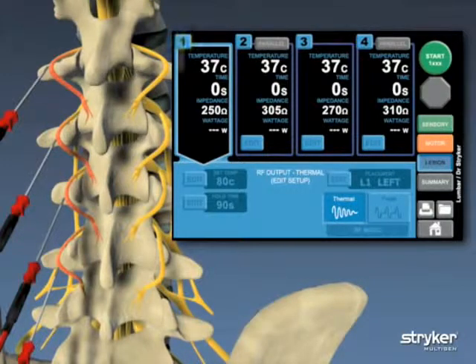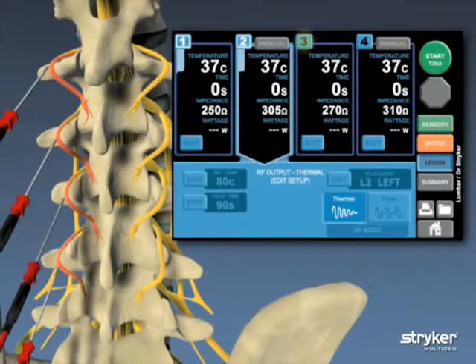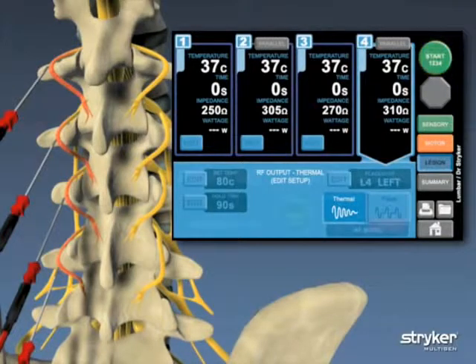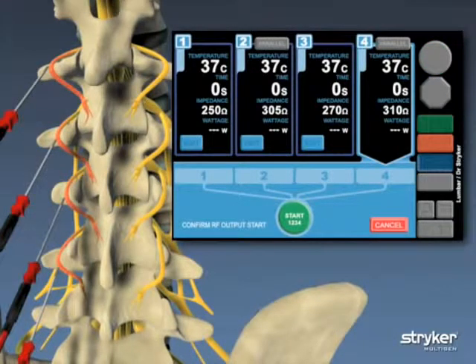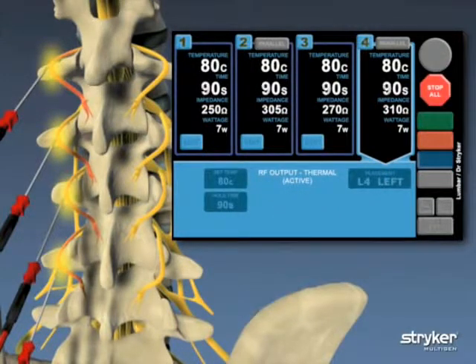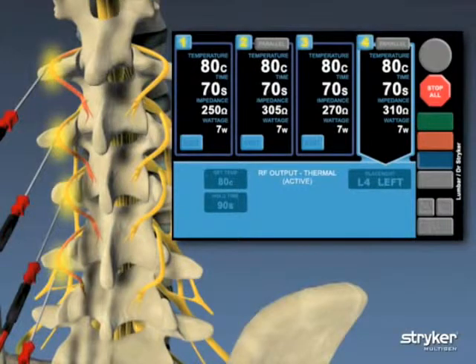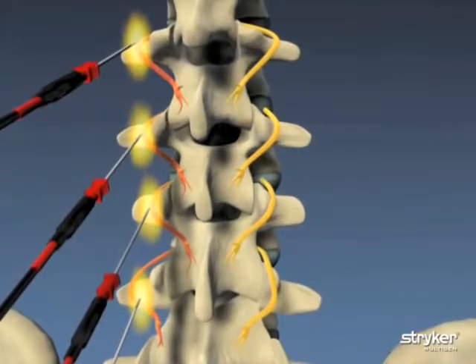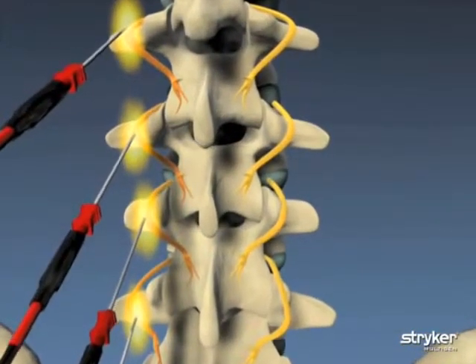The user activates all four needle placements and presses the start button. As an added safety feature, the start button is pressed a second time to confirm that the user is ready to begin. High frequency current heats the surrounding nerve tissue, creating four simultaneous lesions.